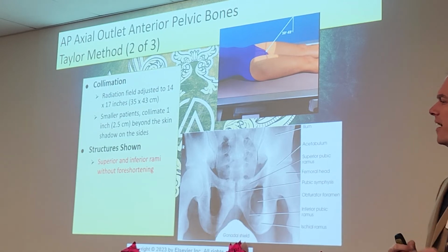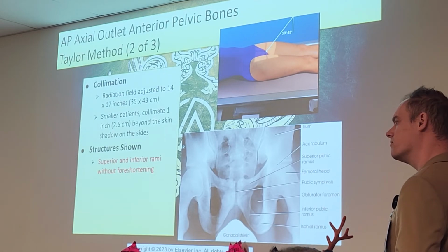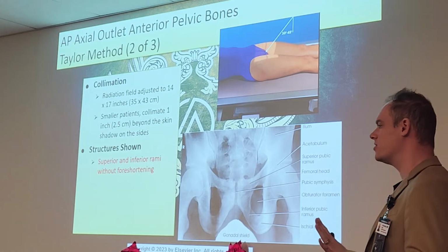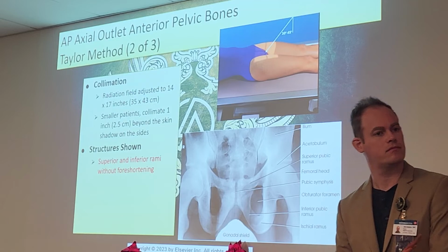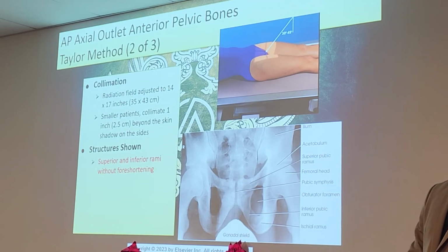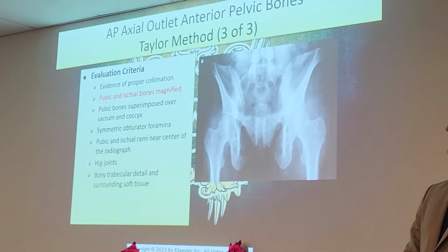I like the next one better for a specific reason. I'll show y'all what I mean. Are these all done at 40 SID? Yes, everything this chapter is 40 SID. Because I thought it's a semester.